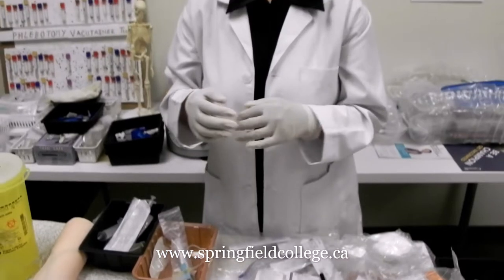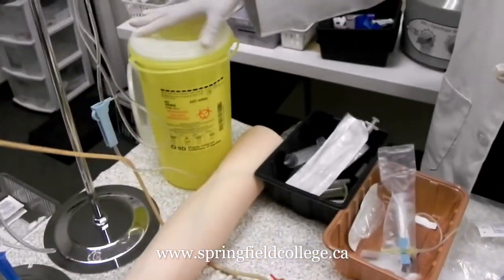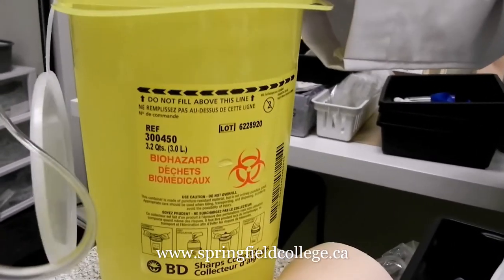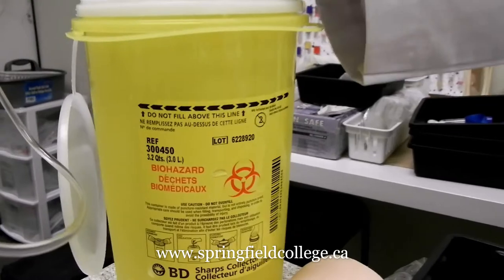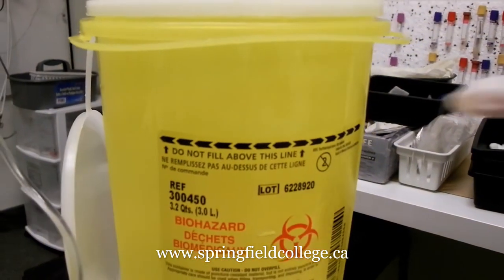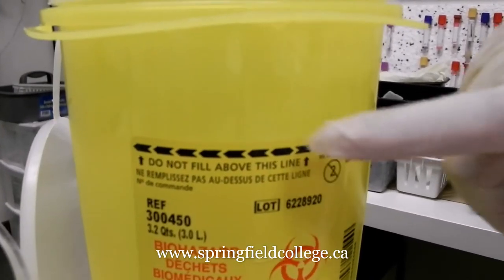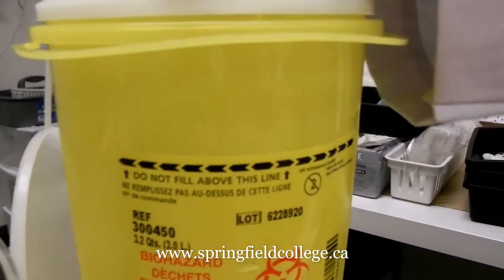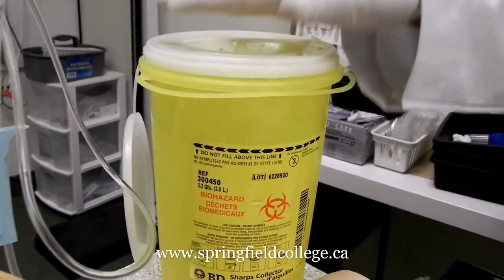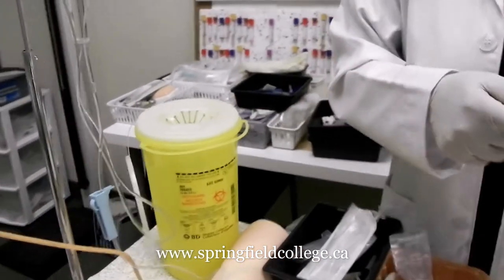The last point is sharp disposal. When it comes to sharp disposal, this is our sharp disposal container. Sharp containers can be of different colors — generally red or yellow like this one. Always remember it should never be filled beyond three-quarters of its level; filling beyond that level is very harmful and hazardous. Remember how to discard it, and it needs to be immediately discarded once the procedure is over.